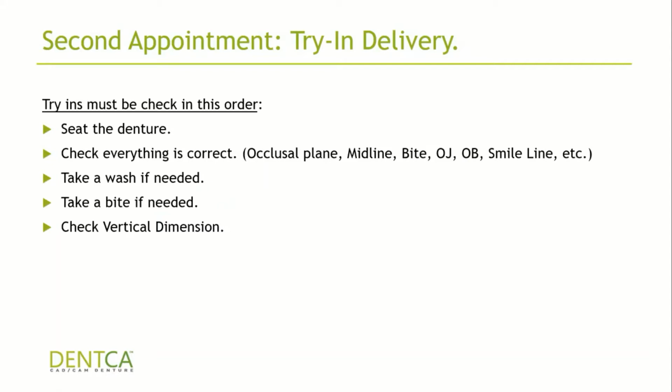I find these papers very helpful because it allows you to write everything down for that patient. And then once you actually go and place that adjustment order online, you already have all the information that you need, or you can give that paper to the assistant and then they can place the order online for you. So it kind of helps you remember what was done and what were the issues with that patient.